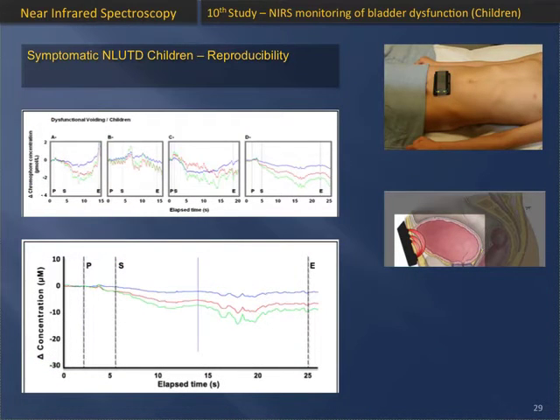That pattern was pretty similar in different cases, different dysfunctions. And this is another case, as you can see, upon uroflow starts, instead of an increase in blood flow and oxygenation of the Detrusor, there was a decrease. In fact, that was a kind of dysfunction inside the bladder muscle in getting more oxygenated blood to be able to have a good contraction.